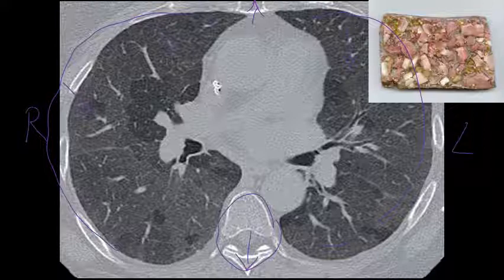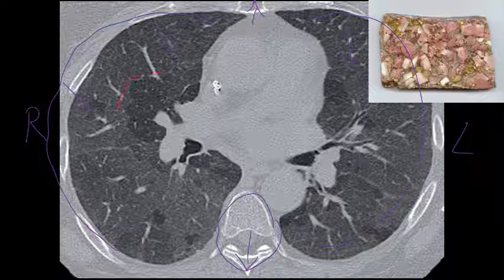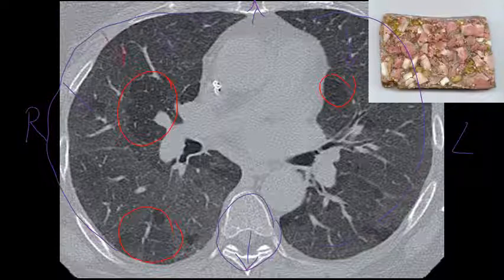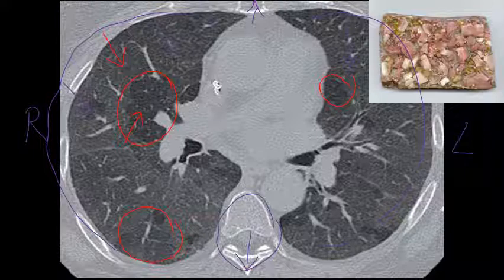Many other lung diseases can show bilateral ground glass opacities, so what's characteristic about this disease? One striking feature is areas of low attenuation — slightly more black compared to the whitish ground glass areas — called air trapping. These areas of lower attenuation are especially seen when the patient expires or breathes air out. The combination of high attenuation areas and low attenuation areas gives what's known as a mosaic pattern on the chest CT, which is one of the characteristic findings of hypersensitivity pneumonitis.